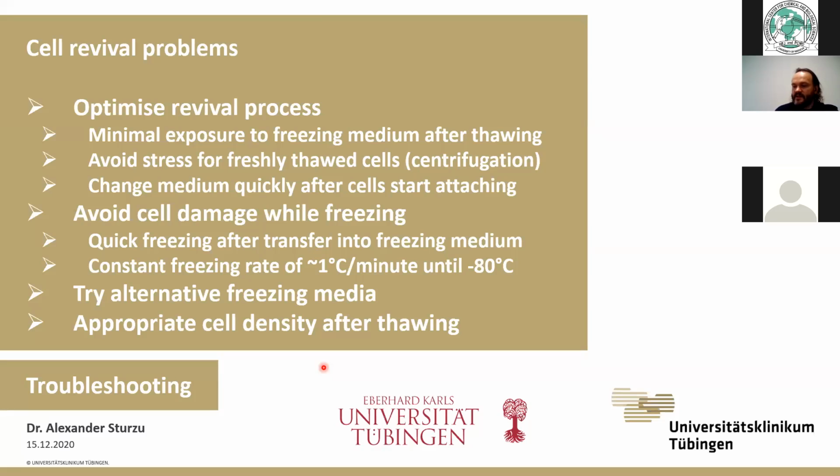And one piece of advice that we found in our lab: some cells, after they are thawed, like to have some cell-cell contact. So if you use too big a dish or flask for reviving, then they will be lacking this contact, and you will have single attached cells. But because there are no other cells close, they will grow very slowly or even start dying off. We have found that some cells really like to have other cells close, with which they can do cell-cell interaction.